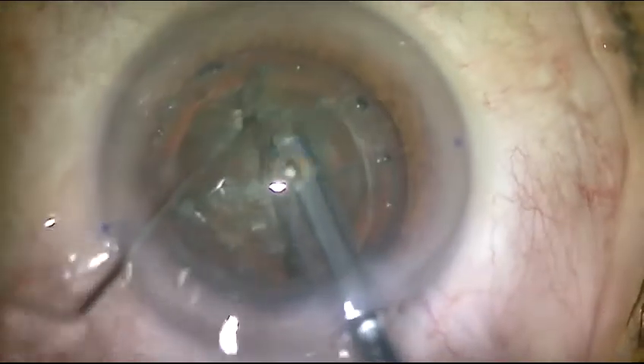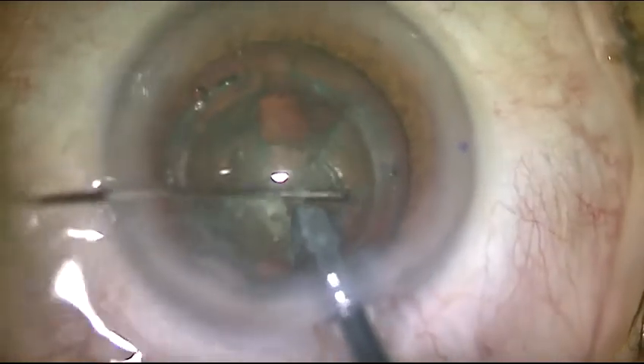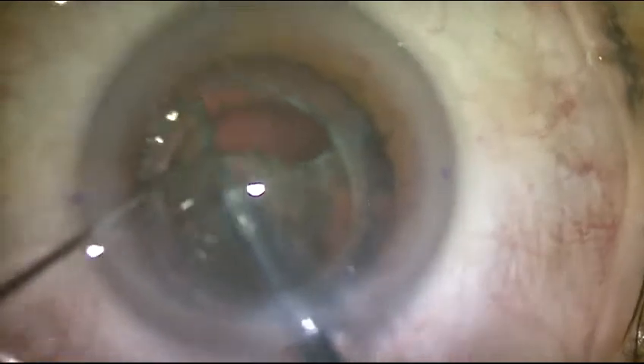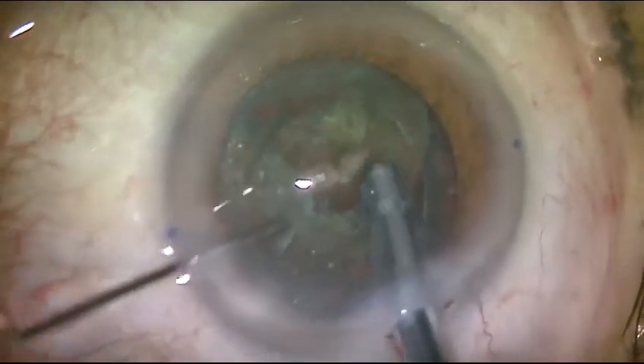The lens is pre-chopped, and all parts can be aspirated without the use of phaco power.